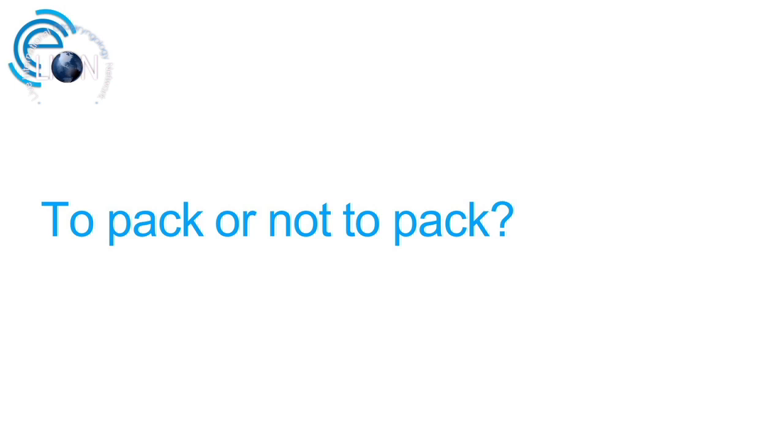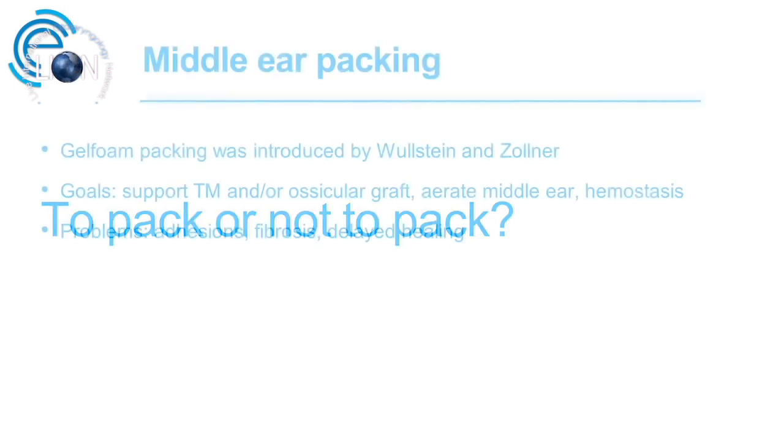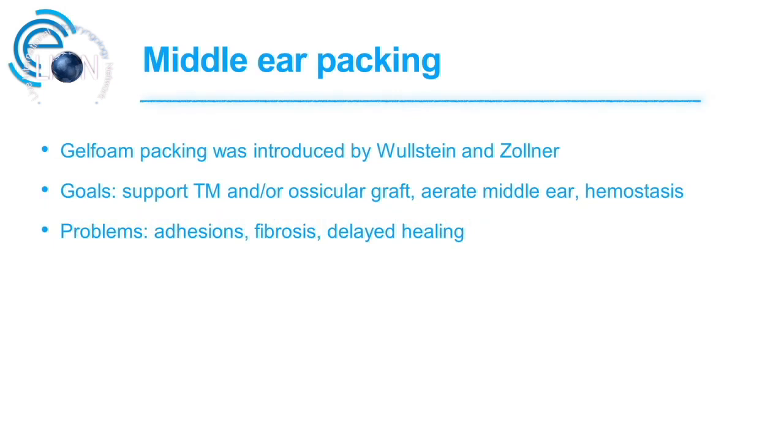Packing, briefly, if we go to the next slide, was introduced a while back. The goal of gel foam packing specifically is to support the tympanic membrane and ossicular grafts if you have them, allow aeration of the middle ear, and potentially deliver some medication, if you soak it in antibiotics and steroids, to a middle ear that's inflamed. And of course, gel foam has hemostatic properties. The problems with it are that you tend to get adhesions, you can get fibrosis, and some would argue that it delays the healing of your graft because you're putting a foreign material there.